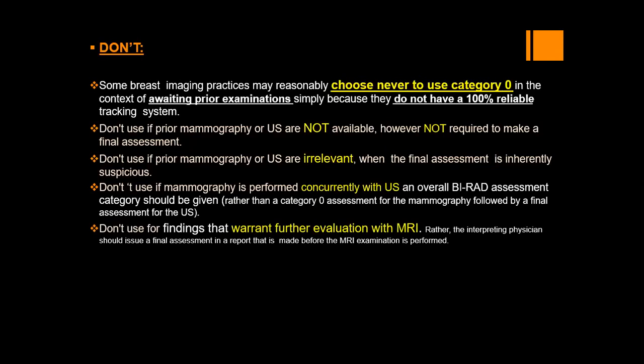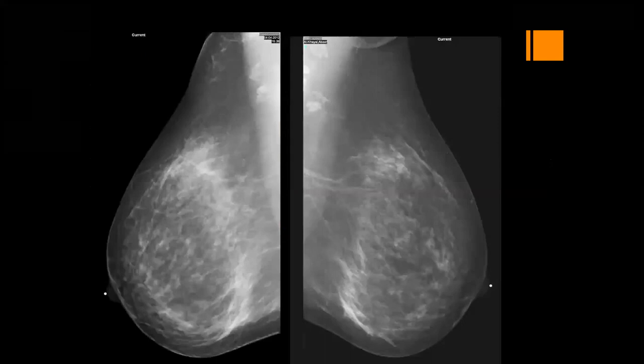Don't use category 0 for findings that warrant further evaluation with MRI. You have to put a final, complete assessment before recommending breast MRI. Okay, what about this?